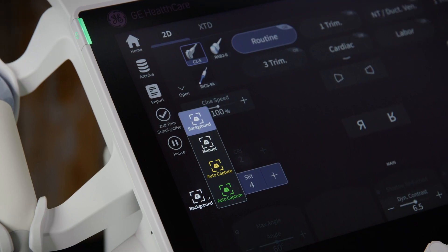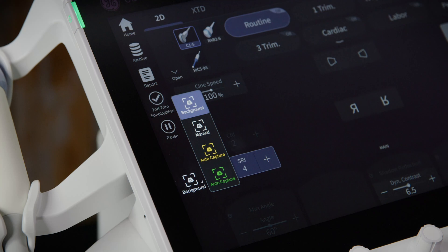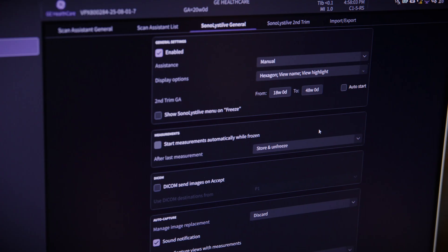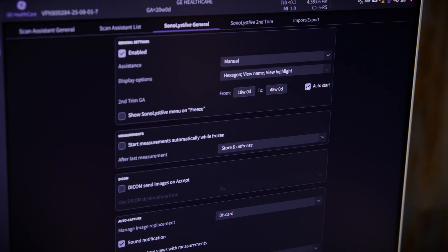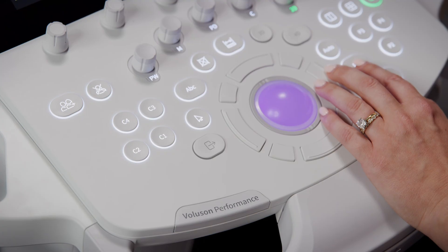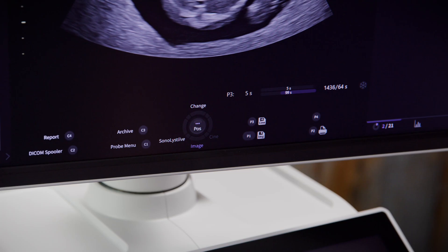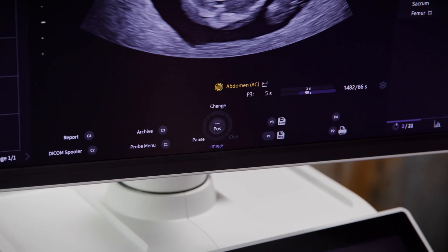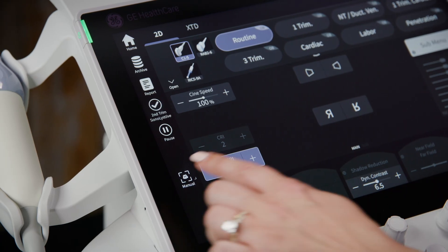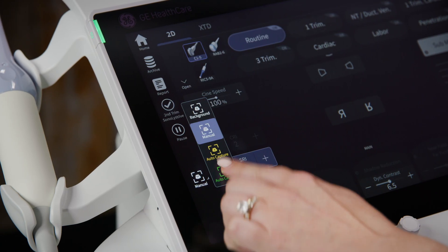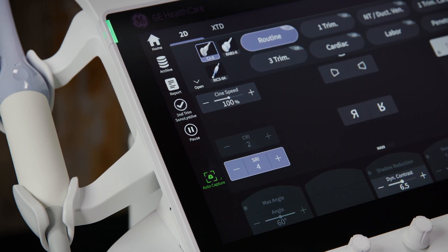Today I'm going to show you the three ways you can use Sonalist Live: background assistance, manual assistance, and auto capture assistance. Sonalist Live can be set to auto start when you begin a second trimester exam, or you can start it manually using the bottom left trackball key. That same key also lets you pause the AI at any time, which is super helpful if you're scanning something outside the configured views. You'll also notice on the left side of the touch panel, you can easily switch between assistance levels during your scan.